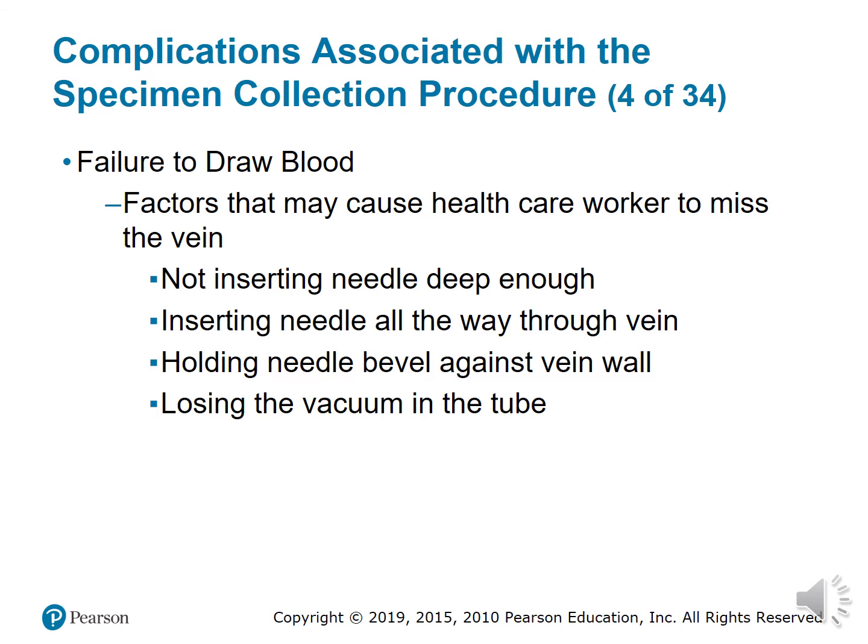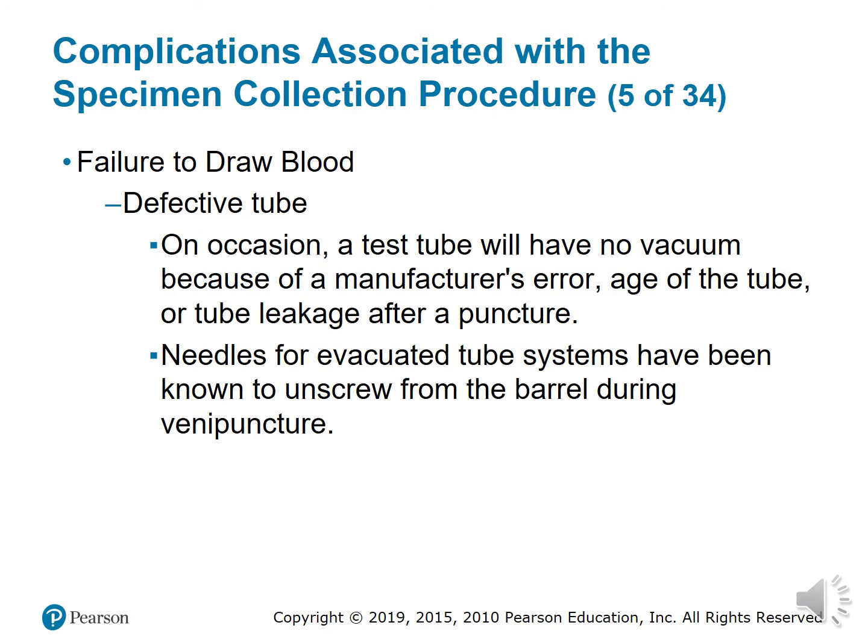These are just a few factors that can cause a healthcare worker not to be able to collect blood. These factors can easily be corrected. As I stated, if you didn't put the needle in enough, push it in some more. If it's too far in the vein, pull it back. If you lose vacuum, change out the tube. If you're up against a valve, pull back. But never, ever, please, never ever probe or dig in a patient's arm. If you have done all the above tricks, just simply remove the needle and start all over again.